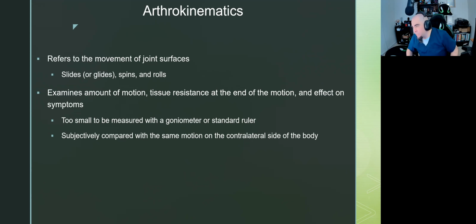And then comes the question usually from somebody: how often do you measure the other side, Mr. McKeever? It depends. If I'm working on a patient whose right shoulder is the problem, and I know their left shoulder is within normal limits, completely normal with no abnormality, I don't measure that left shoulder every visit, but I may measure the right shoulder every visit. For the eval or the re-evals for the PT, when I'm providing them with range of motions, I usually will measure that left shoulder to give something to compare to.